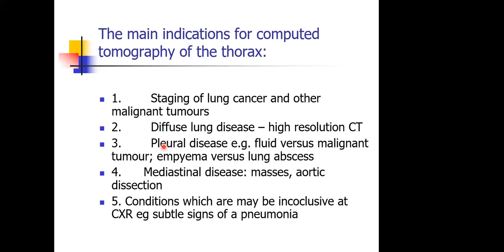Disease processes in the mediastinum. So you can think about all those structures within the mediastinum. We assess them right from the heart. We do a lot of coronary angiographies in case we're suspecting ischemic heart disease. We use it a lot to assess those major blood vessels in the mediastinum.